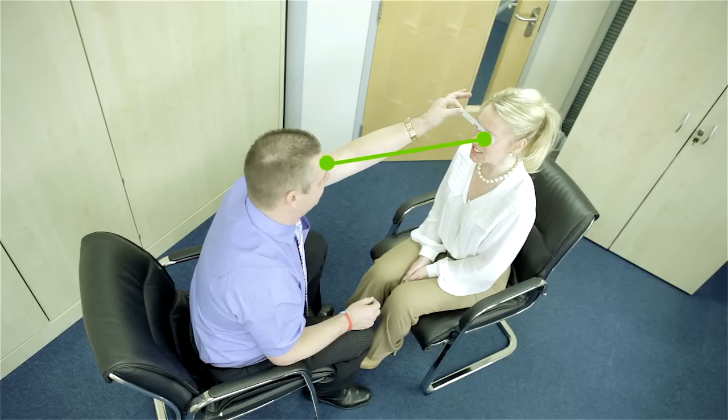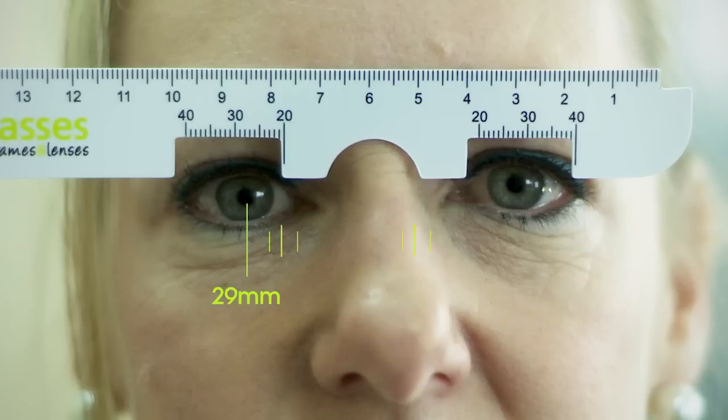Without moving the PD ruler, the person taking the PD measurement should close their left eye and use their open right eye to look into your left eye directly opposite. Again, make sure you look directly into their open eye as you are being measured. Make a mental note of the second measurement from the bridge of the nose to the center of the pupil in millimeters.